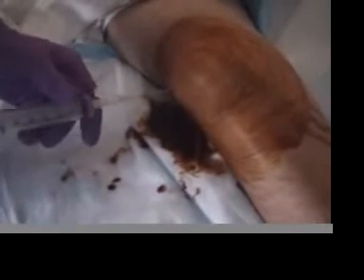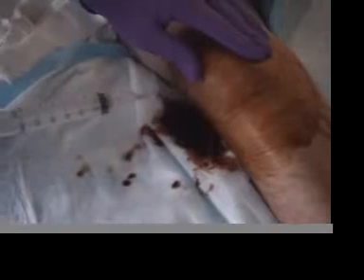Aspirate as you enter the joint space laterally. The needle should pass right below the patella. You can also try pushing the effusion from the medial side with your opposite hand towards the needle.